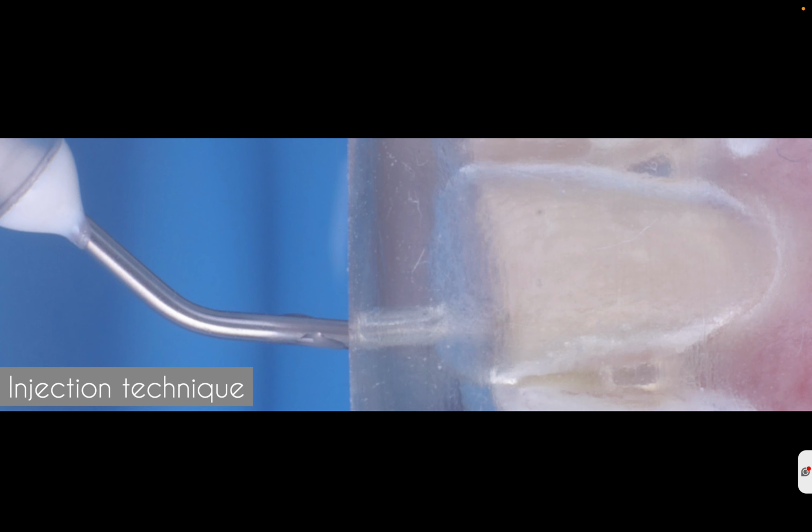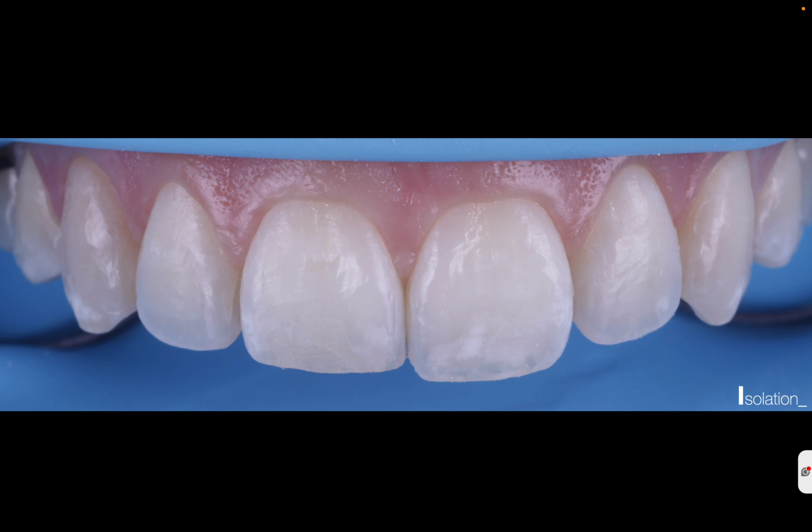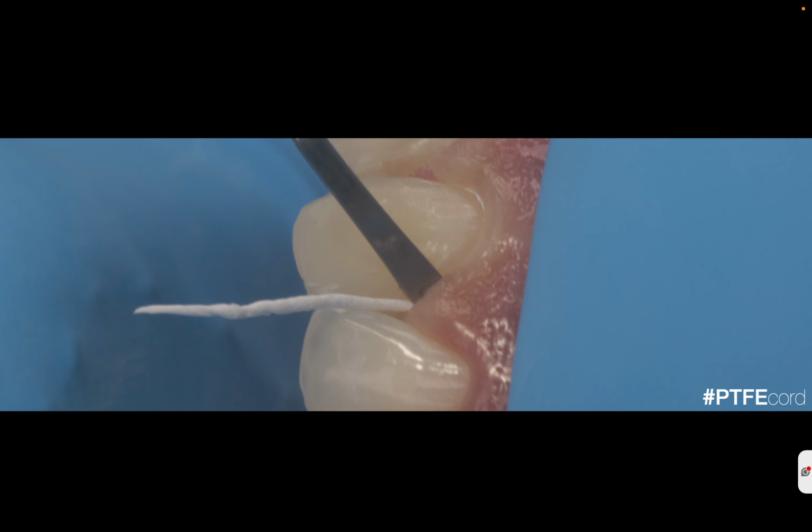Regarding the technique, first of all, it's impossible to do full isolation. We need to reach the gingival area, so we cannot do this kind of complete isolation. I strongly recommend just placing a retraction cord, or if possible, a Teflon or PTFE cord inside the sulcus.